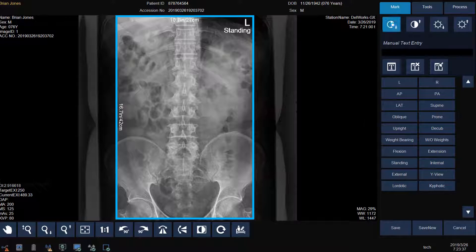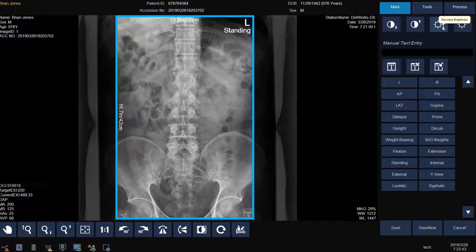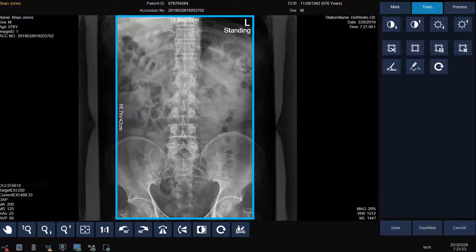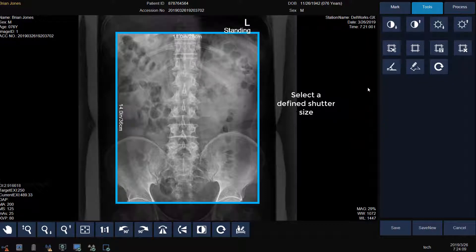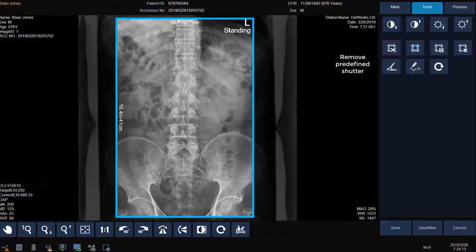On the right side of the screen, there are three additional tabs for modifying your image: Mark, Tools, and Process. Under the Mark tab, you can adjust the brightness and contrast of the image or add a text annotation. Under the Tools tab, we can also adjust the brightness and contrast. We can add a predefined shutter size, remove that predefined shutter, save it, or remove the shutter altogether.